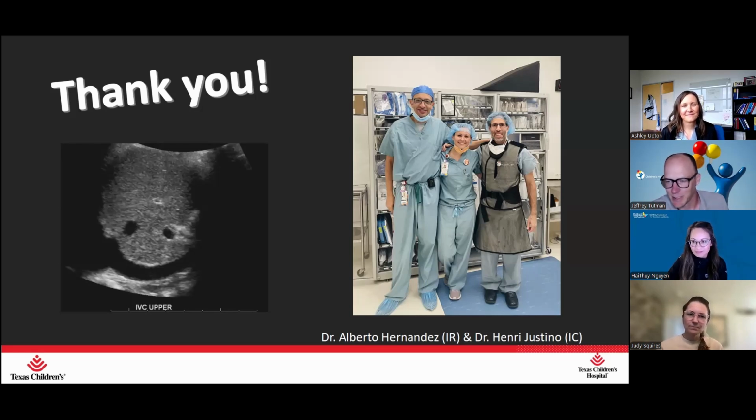And one of the questions was about that. What are you reporting, either meters per second or kPa? We actually report the kPa, but it sounds like maybe you guys are different. But yeah, we do meters per second. We do both. I was thinking we should probably do both, because that would be helpful. People wanted a little extra here.